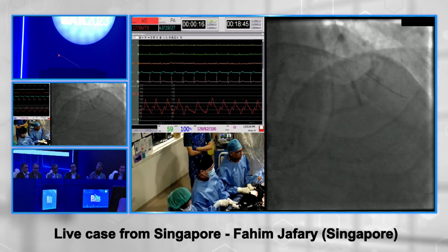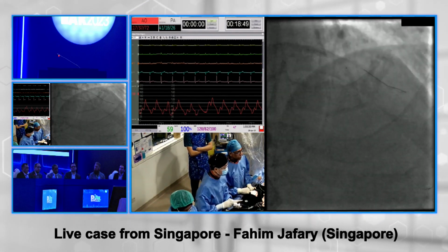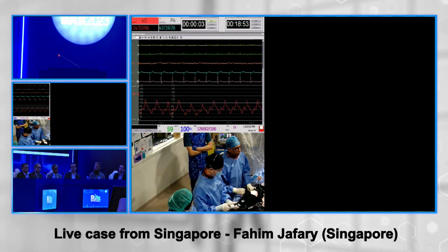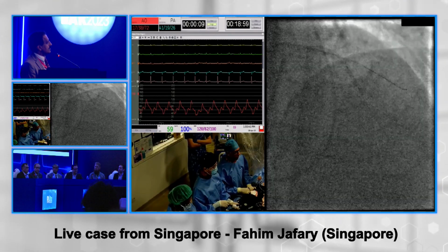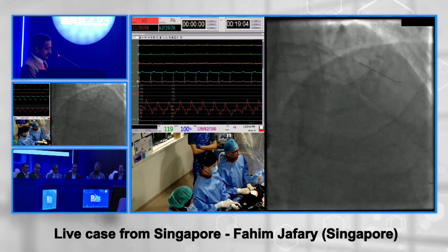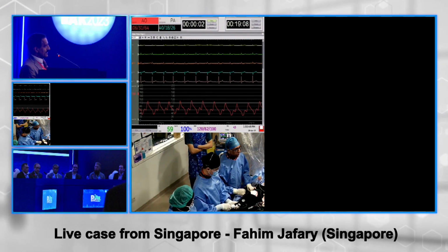And as I think Nadeem and Ashok said, symmetry is not a huge issue. This is not cosmetic surgery. If it's oval but good area, I think by and large you're okay. Okay, so we're going up with a 3.0 NC distally to post-dilate, and then we'll go with a 3.5 proximally. Fahim, we have only 3 minutes left, so please if you could.